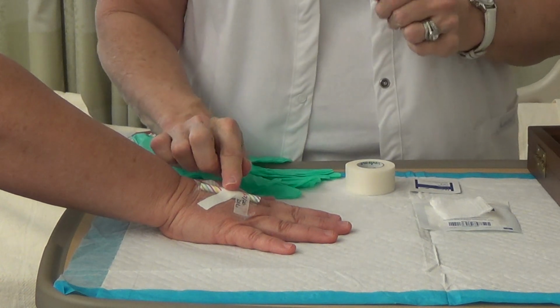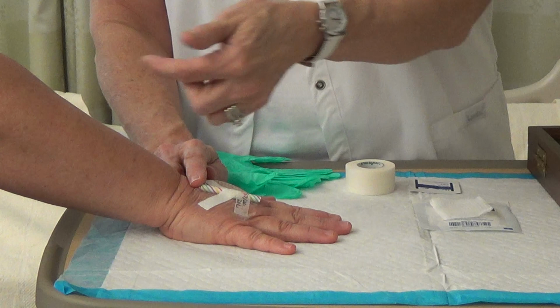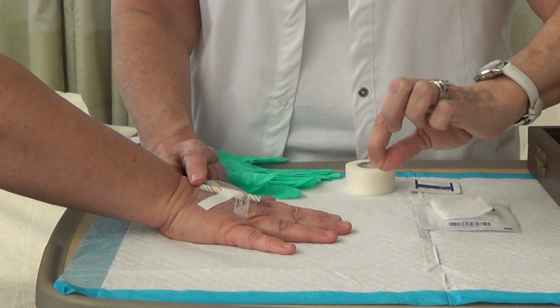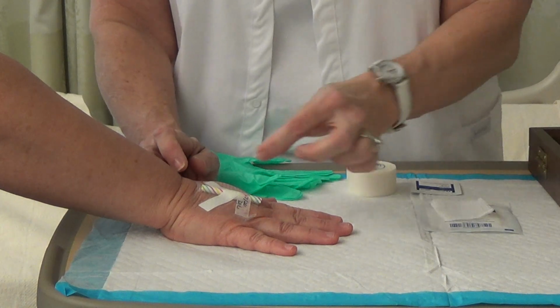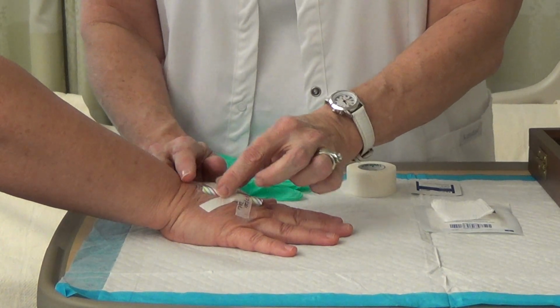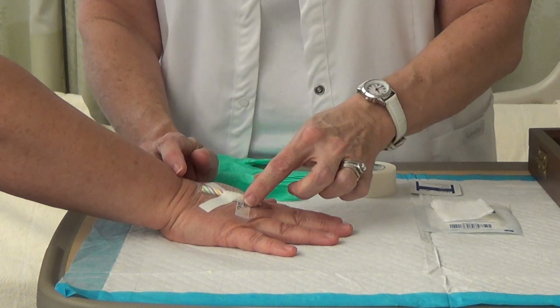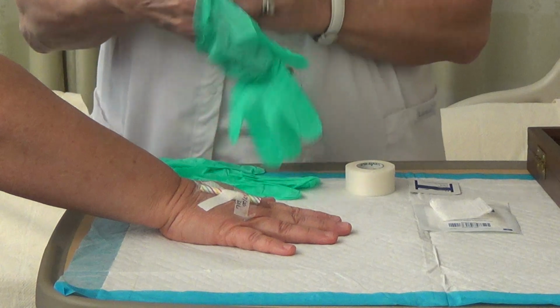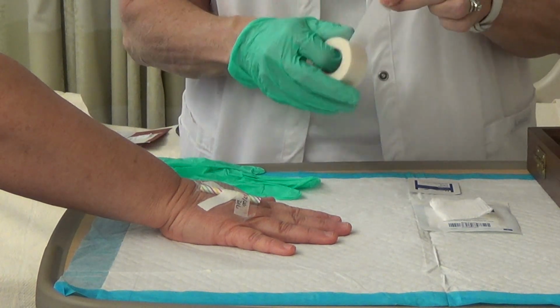With the IV sites, we're going to remove the dressing towards the insertion site. We don't want to pull it away from the insertion site because you'll remove the catheter prematurely, and we don't want to do that. If there's a lot of jiggling around of the catheter inside of the vein, you're going to cause damage to what's called the intima, the inner lining of the vein. So I'm going to demonstrate that. I'm also going to get a piece of my tape ready to go.